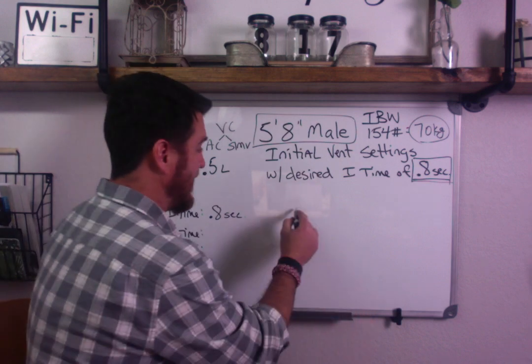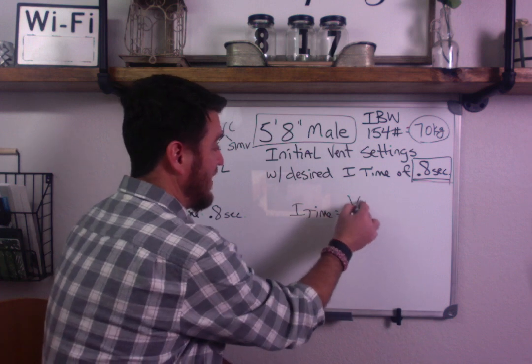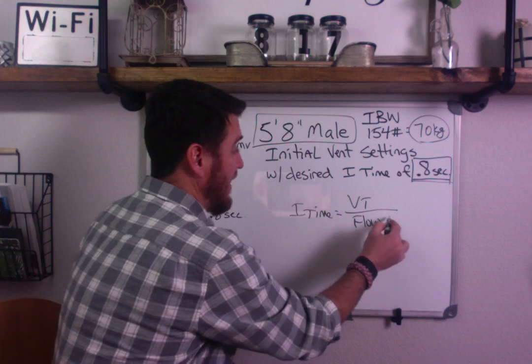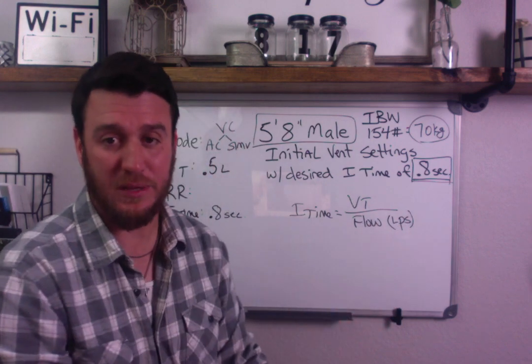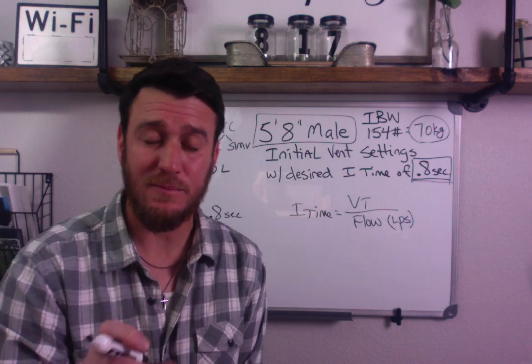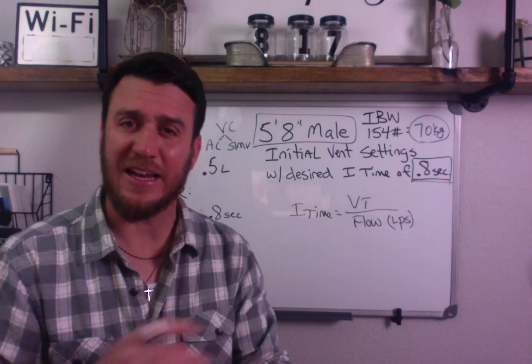And that one formula is that I time equals tidal volume over flow. And this is in liters per second. That's important because when we talk about flow, we talk about it in liters per minute. But in this case, you have to turn it into liters per second. And this is going to make sense.